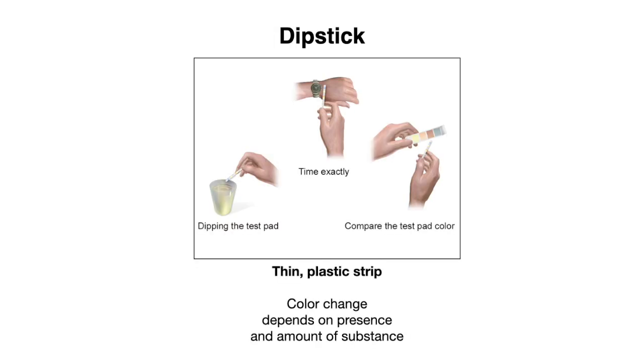Let's now move on to our second component, which is the dipstick analysis. And this is what you'll oftentimes see is done in an office setting when we collect a urine sample from patients, and it provides you with most of the information that you're looking for.